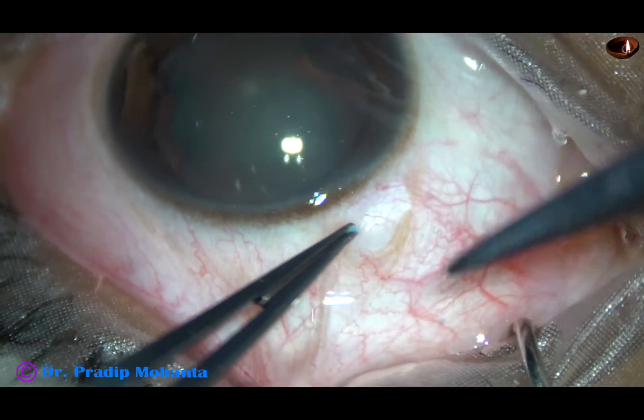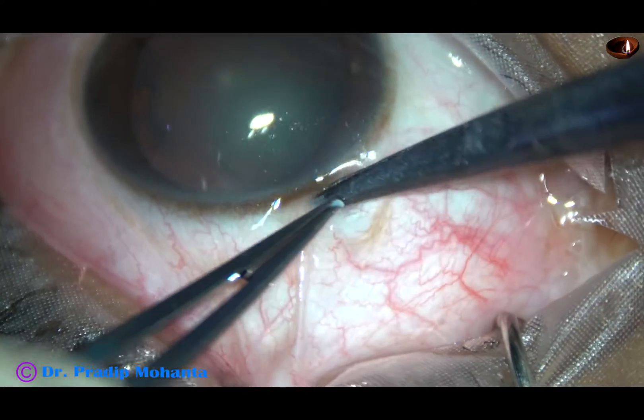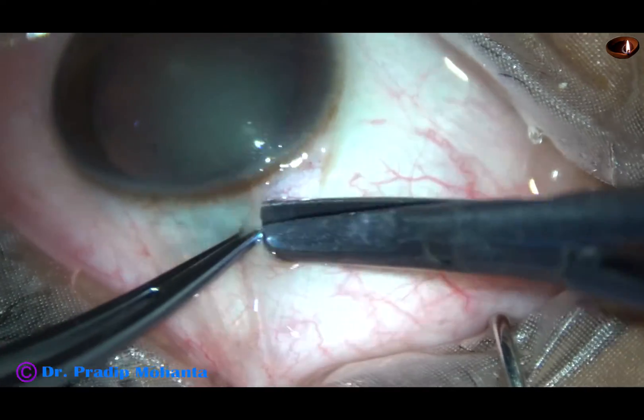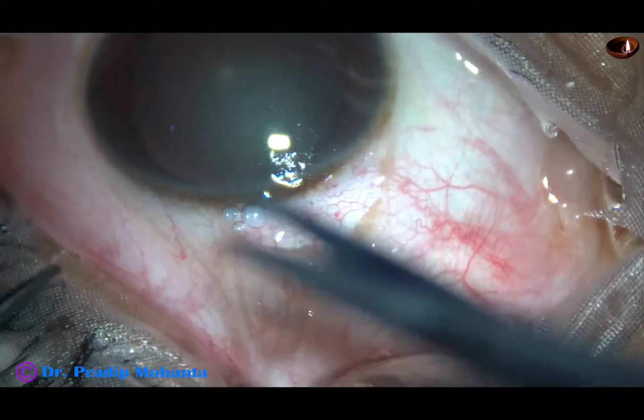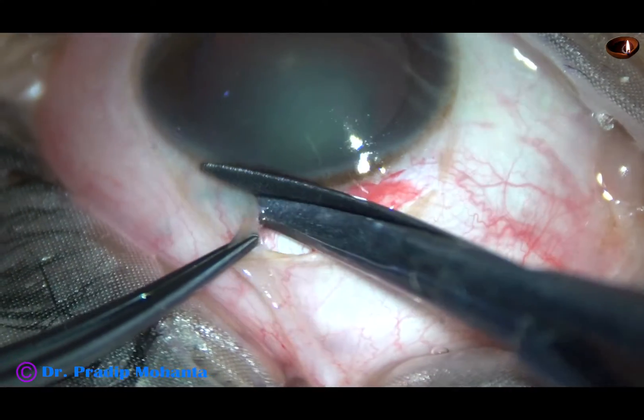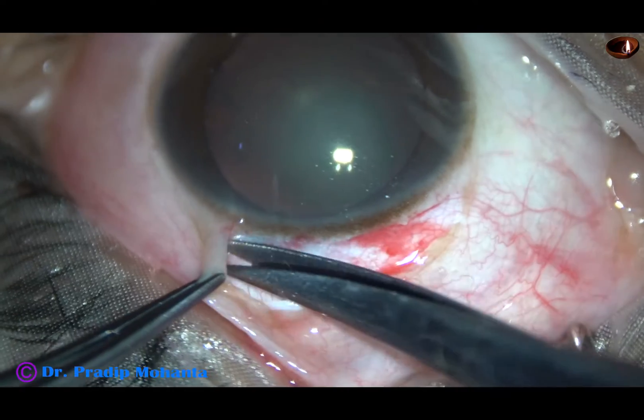So here is the surgery. This is conjunctival peritomy for about 2 clock hours, from 11 o'clock to 1 o'clock. So the peritomy is done.